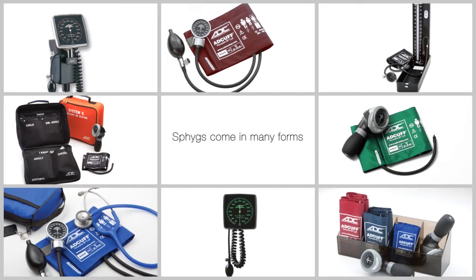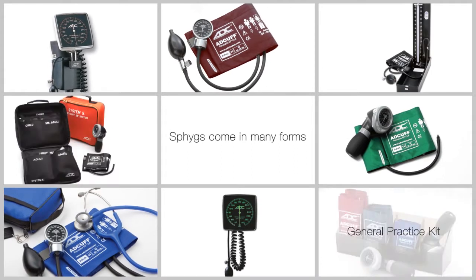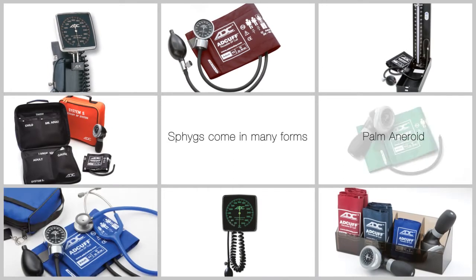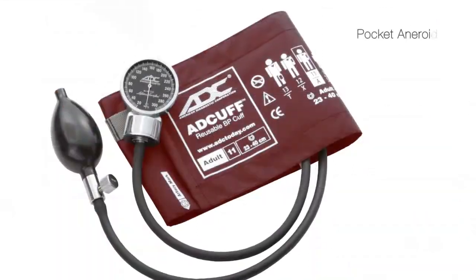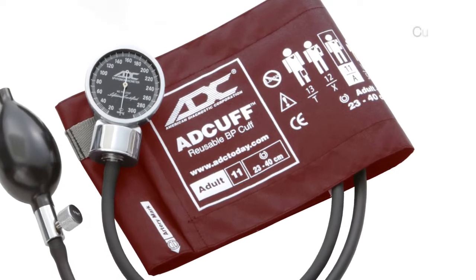ADC is the leading U.S. manufacturer of manual blood pressure instruments known as sphygmomanometers. The most popular type of manual sphygmomanometer is the aneroid, which uses a mechanical gauge to measure the air pressure applied to the cuff.